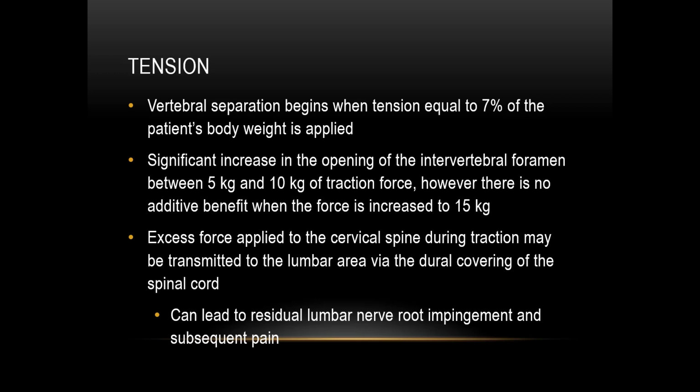Excessive force applied to the cervical spine during traction may be transmitted to the lumbar area via the dural covering of the spinal cord. This can lead to residual lumbar nerve root impingement and subsequent pain.